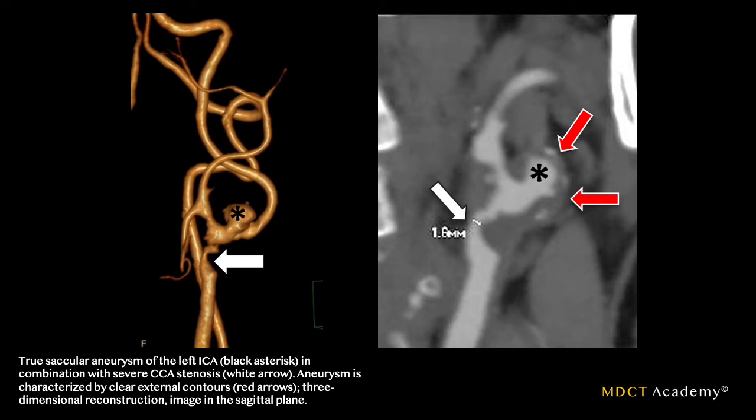This next case also demonstrates a true saccular aneurysm of the left internal carotid artery in combination with severe carotid artery stenosis, shown by the white arrow. The aneurysm is characterized by clear external contours shown by the red arrow and 3D reconstruction in the sagittal MPR. You can also have pre-stenotic and post-stenotic dilation, which further characterizes this finding.